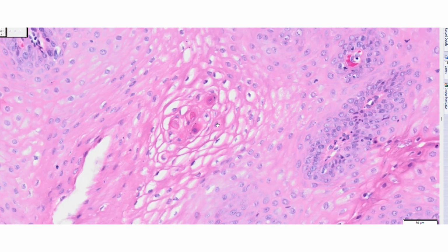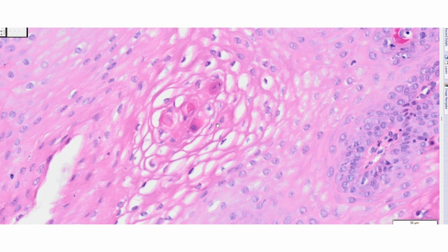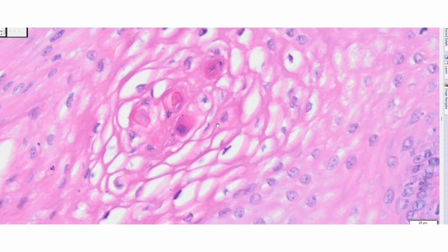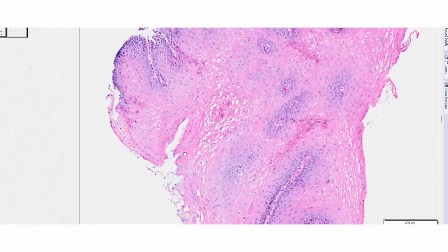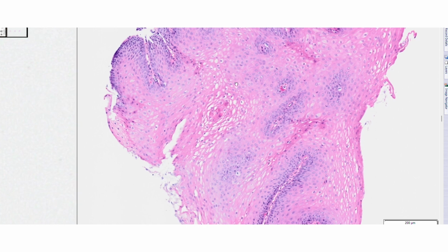I was debating whether or not these could be eggs, but they're too small to be schistosomiasis eggs, and I believe that they are cross sections of worms, and the tissue surrounding is, again, not inflammation, but a hypereosinophilic response with clearing out of the cytoplasm, as if the worm is eating the glycogen in the cytoplasm of the cells.